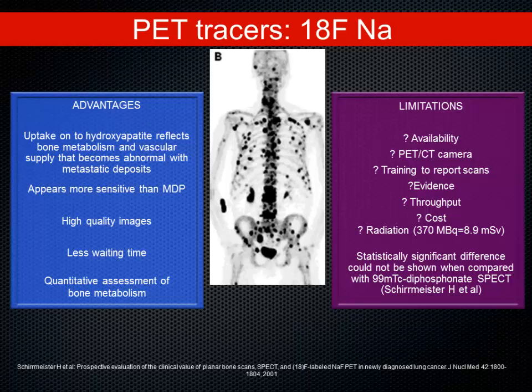And still, we are dependent on the MDP bone scans. Whenever we do fluoride, it is mostly for research purposes, especially fluoride and choline. It is still in the research phase in terms of cost effectiveness and other aspects. And the cost is again a problem because you can do a bone scan for half this cost. So who's going to pay for it is the question.